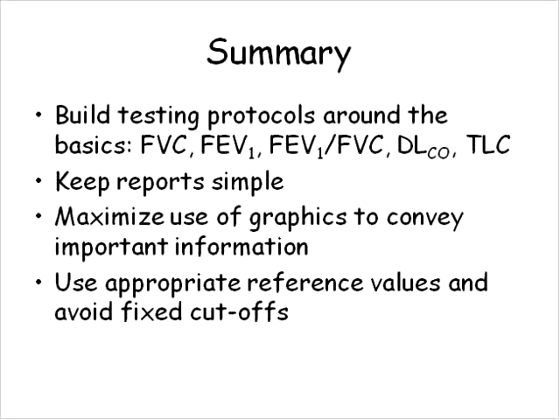Again, I'm referring back to doing good acceptable spirometry. In many instances, if you're using a spirometer in which the patient has to put the flow sensor in their mouth after they've taken the big breath in, you have really no way of knowing, did the patient really take a big breath in? In other words, are they really exhaling beginning from total lung capacity? And that's what we want them to do.